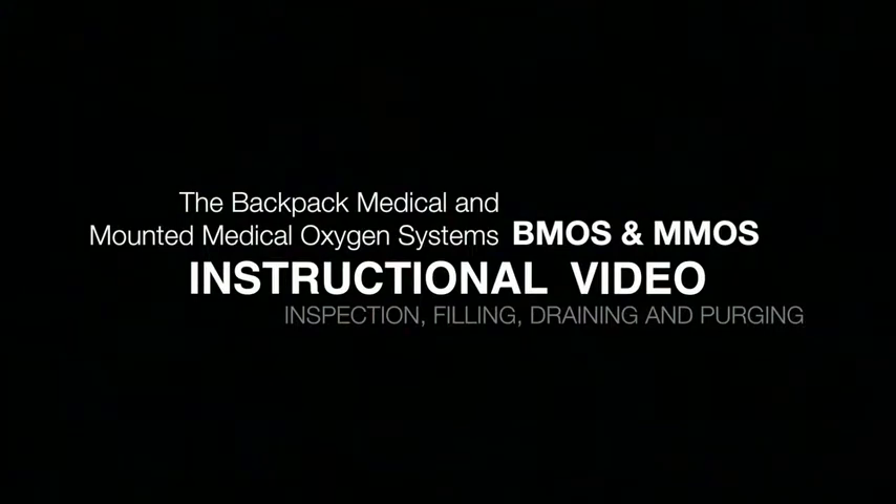The following information should be used as a general guide for the inspection, filling, draining, and purging of the BMOS and M-MOS LOX converter units.